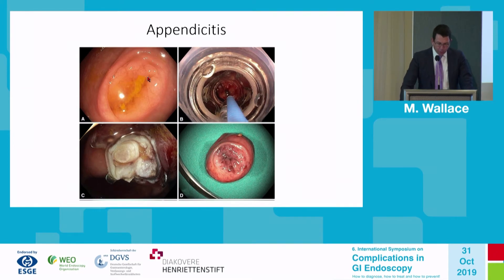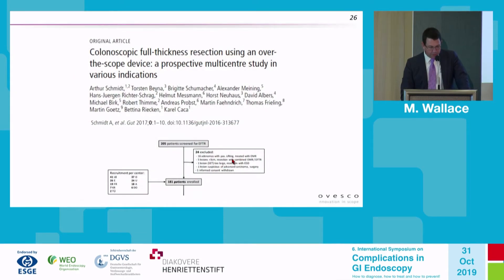Appendicitis is turning out to be one of the most common complications — limited to cases with a lesion at the appendiceal orifice, such as a typical sessile serrated lesion. The lesion is pulled into the cap and the clip is deployed. You can see the muscle layer of the appendix extending down into the cap, and here is the endoscopic view of the resected appendiceal orifice.